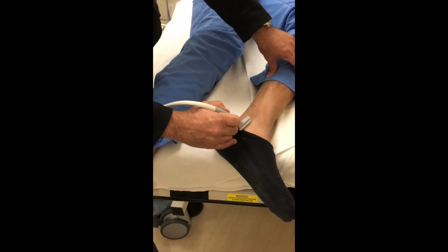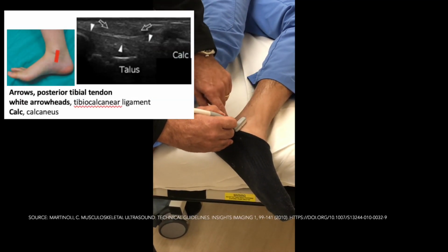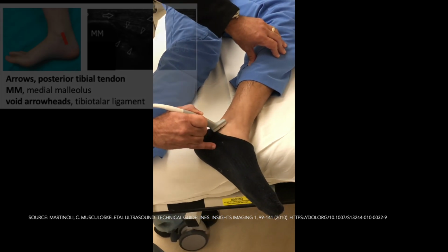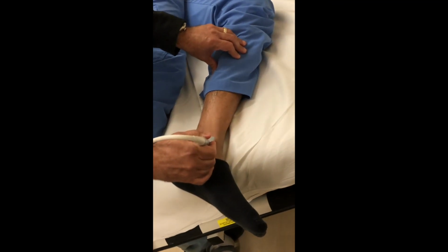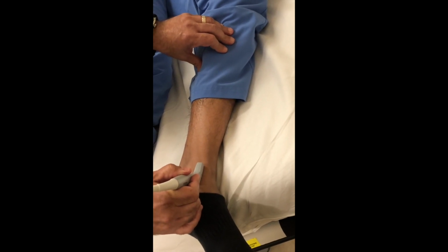Next, we will check the deltoid ligament by placing the transducer between the medial malleolus and the calcaneus, interrogating both anteriorly and posteriorly for any gross disruptions. Lastly, we can check the anteromedial gutter of the tibiotalar joint to look for any cysts or joint effusion.